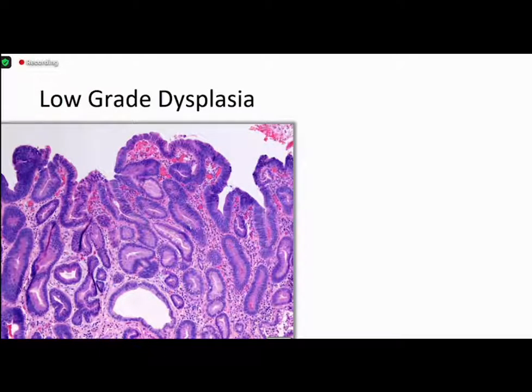For low-grade dysplasia, the way I think about it is that it would have more of the cytological features and would be lacking mainly the architectural complexity that would be required for high-grade dysplasia. So we would see this epithelial transformation with pencillate, elongated nuclei with nuclear stratification that we can see here. And some mitosis would be seen, but overall we won't see the more filling of the glands or cribriform formation that we would see in high-grade dysplasia.